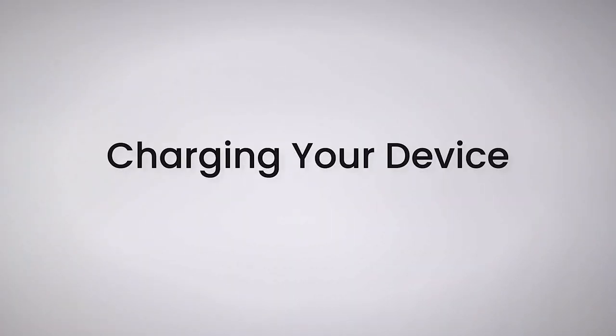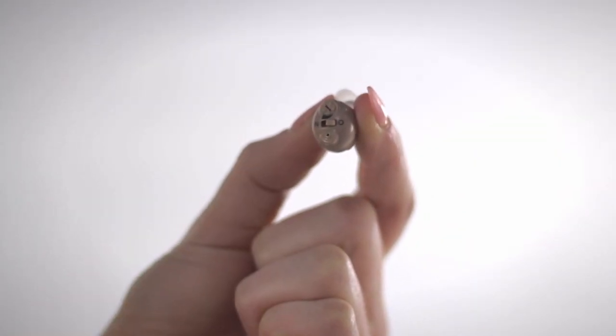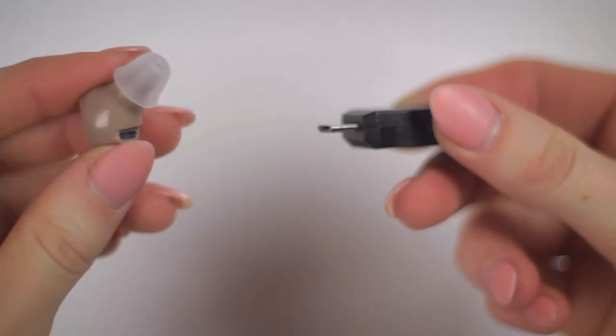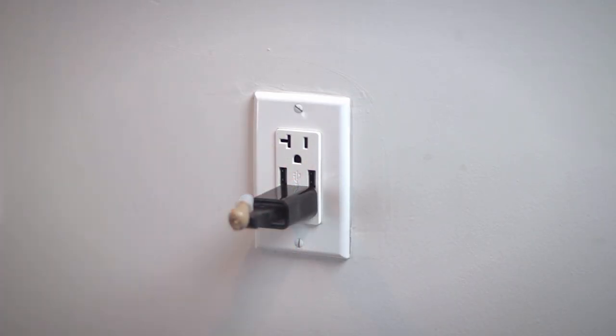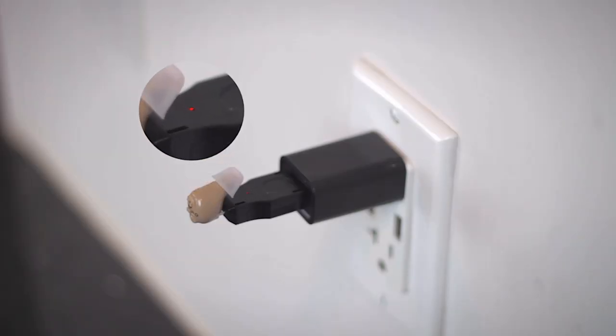Charging your device. Remember to turn the hearing device off before and during charging. Insert one end of the charger into the wall power adapter and the other end into the hearing device's charging port. Then, plug the charger into an electrical outlet to begin charging. While the device is charging, the LED light will glow red.